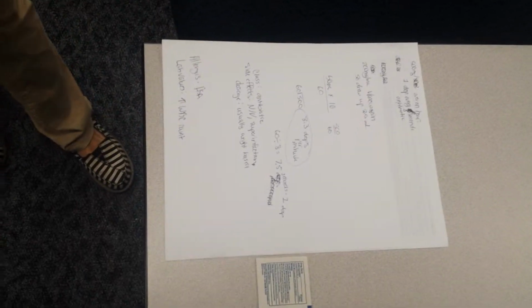I'm going to show or demonstrate an IV medication. So I'm going to look at my doctor's orders. The doctor wants 500 milligrams of vancomycin given over an hour.